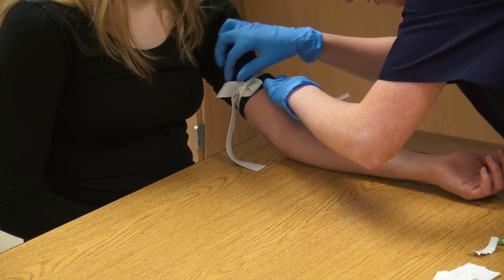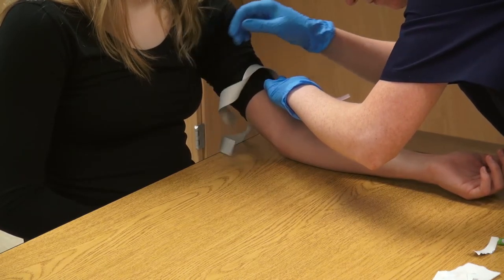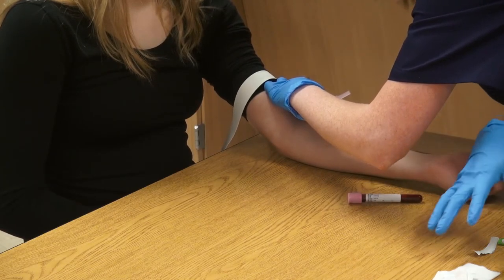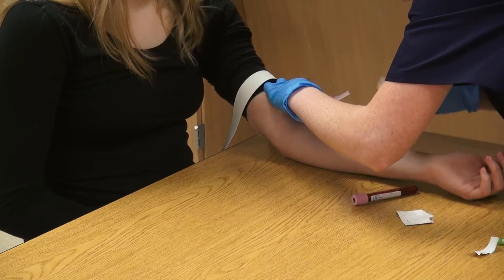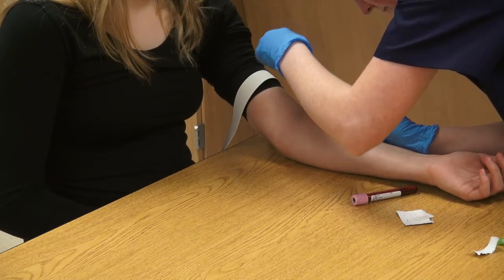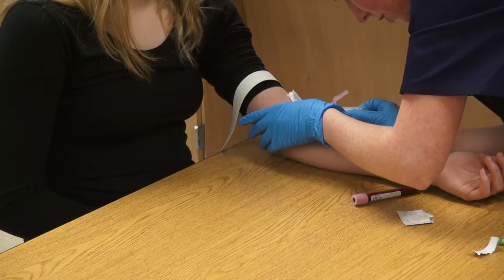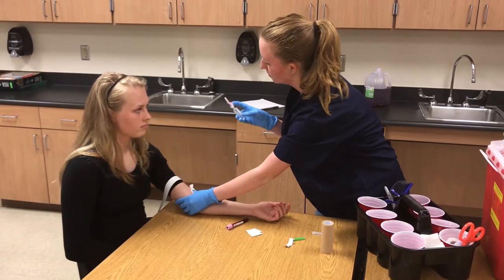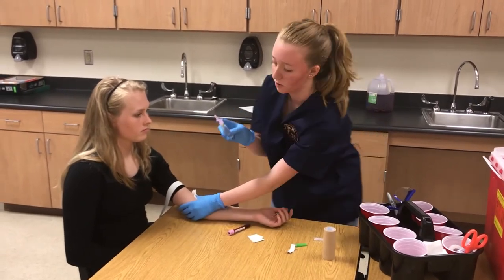Remove the tourniquet and remove the vacutainer. Apply the gauze without putting pressure and take the needle out. Flip the safety cap so you don't cause any needle stick injuries.